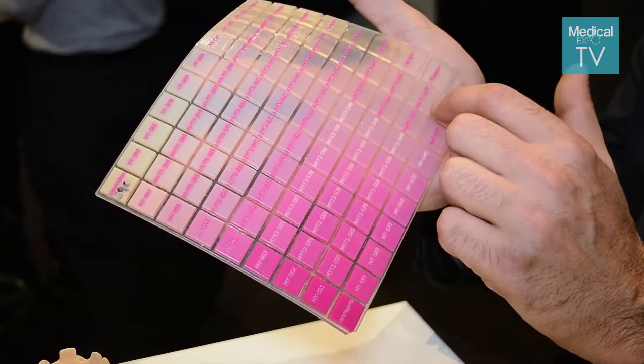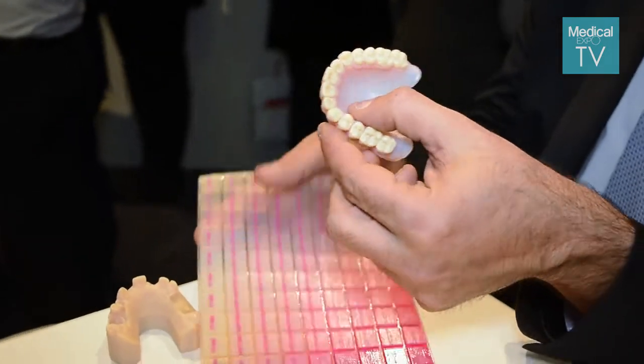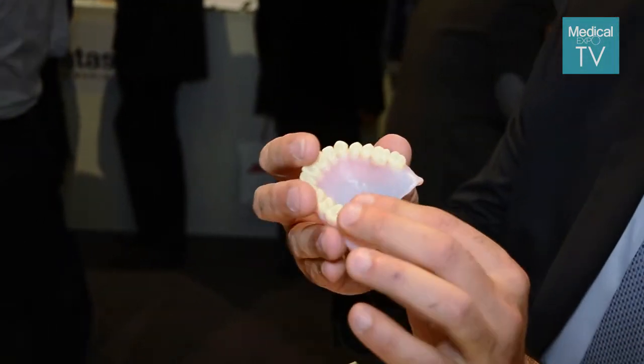From teeth color to gum-like material, we can look at this sample printed in one print, in one shot: teeth in an A2 shade color and a denture printed in flexible gum-like material.